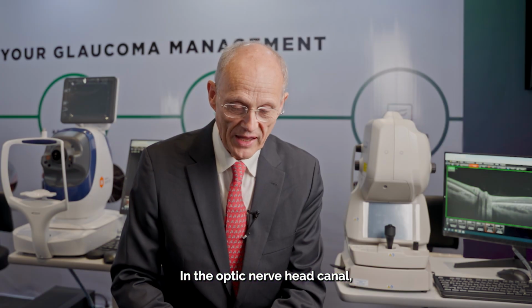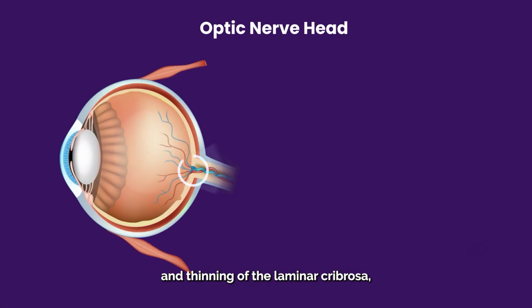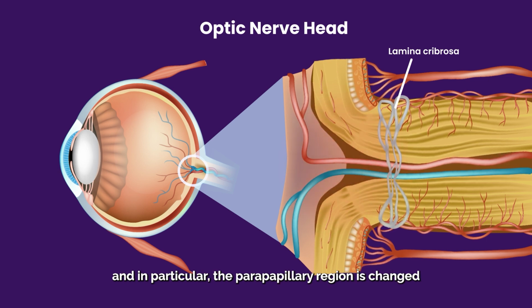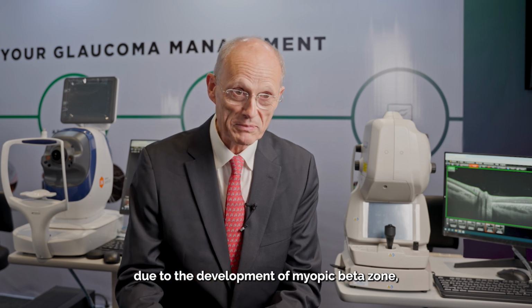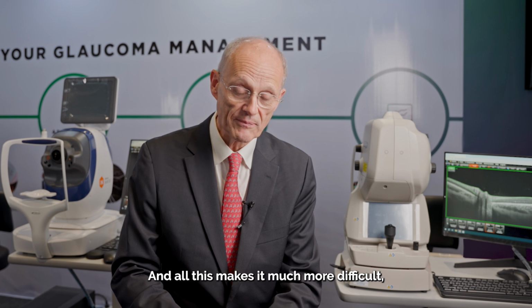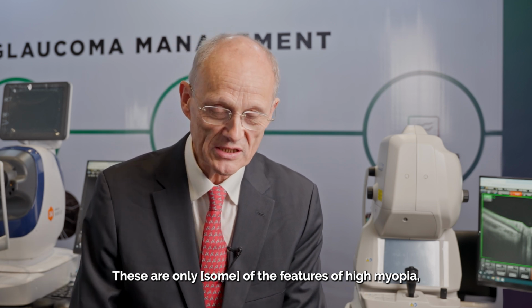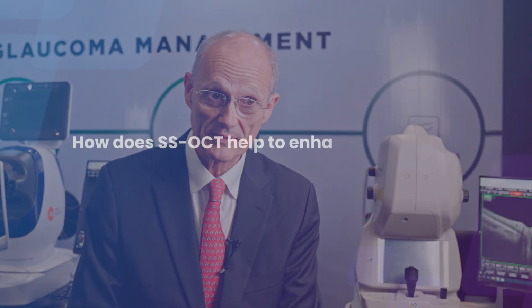In the optic nerve head canal, you get a stretching and thinning of the lamina cribrosa, an enlargement of Bruch's membrane opening, a change in the appearance of the neuronal rim, and in particular the parapapillary region is changed due to the development of myopic beta zone, gamma zone, and delta zone. And all this makes it much more difficult also for the imaging devices to measure the retinal nerve fiber layer thickness there. These are only some of the features of high myopia, leading to problems in diagnosing glaucoma.